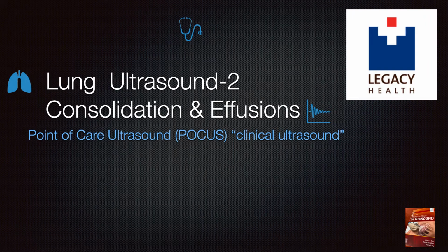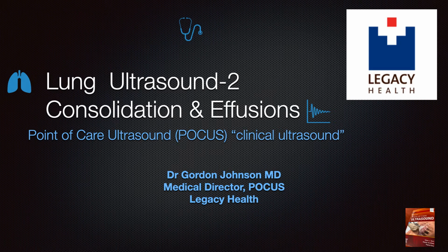Welcome to the second module on pulmonary and lung ultrasound entitled Consolidations and Effusions. You should have seen the first module regarding interstitial syndromes. I'm Dr. Gordon Johnson with Legacy Health.